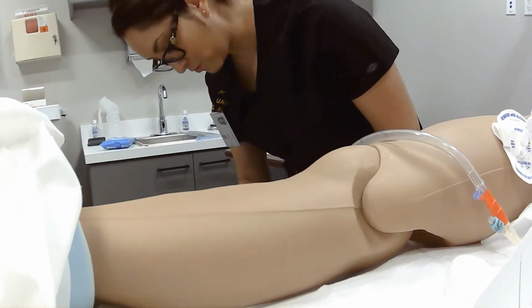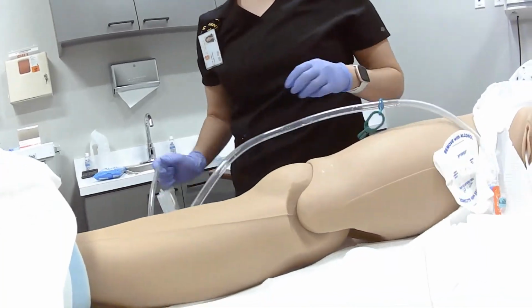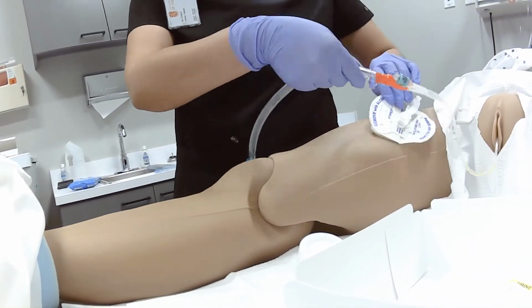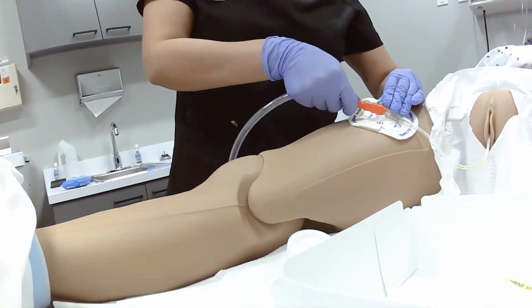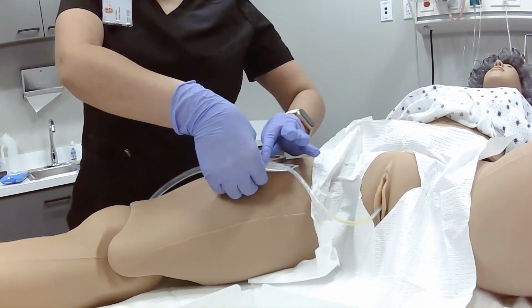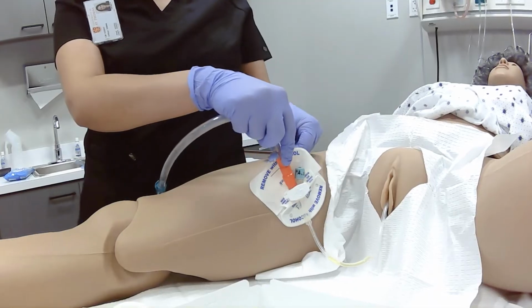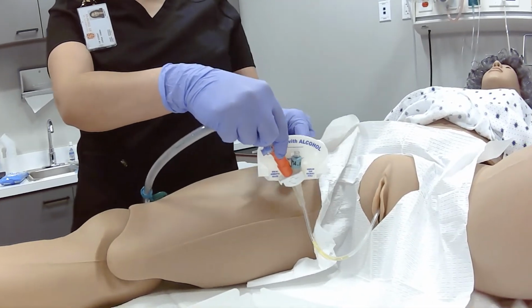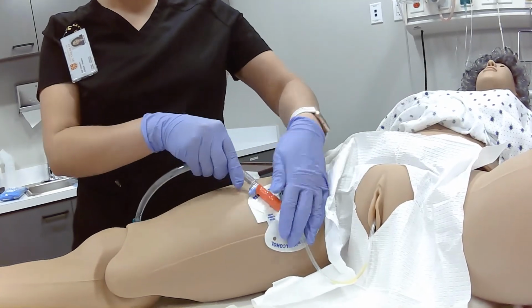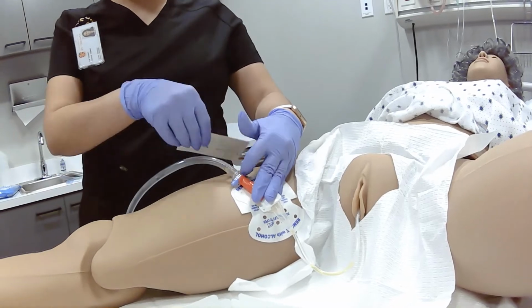After that, what you'll need to do is collect the urine. So we'll make sure this is connected back. Hold on. Just attach it there. So we would get some alcohol.